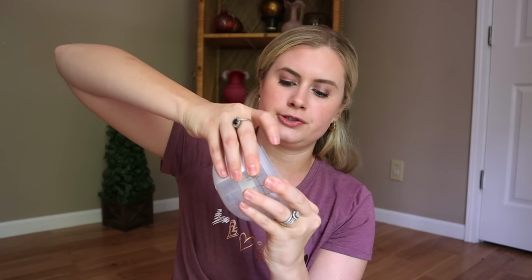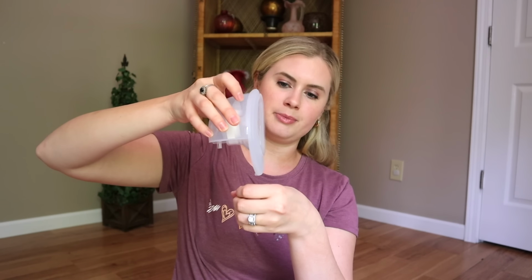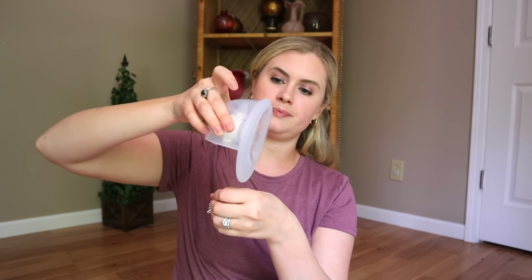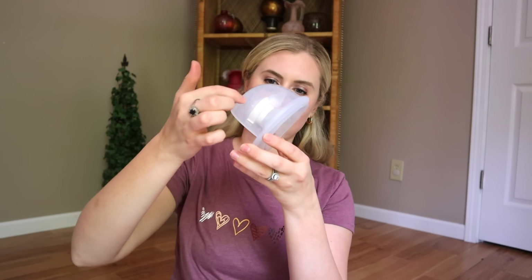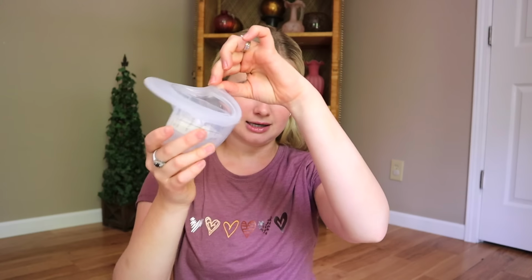When you're done pumping, you can lift it off. There's grooves on either side of your pump, so use those grooves to lift off your motor. And then it's actually recommended that when you're pouring your milk out into a bottle, you pour it like this, so like this instead of like this. If you pour it like this, more milk will just come out of your containers. As you can see, then the milk will all run down. But if you see a little milk still in there, you can just raise this up and pour that last little bit of milk into your bottle.